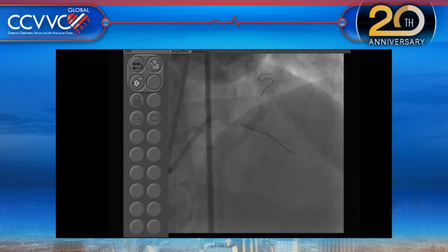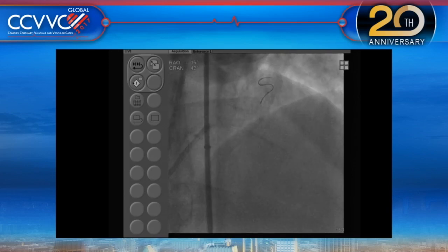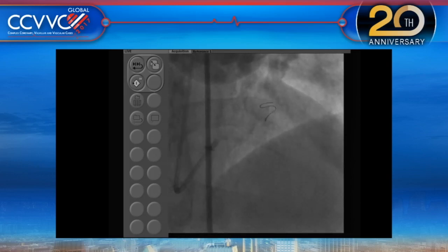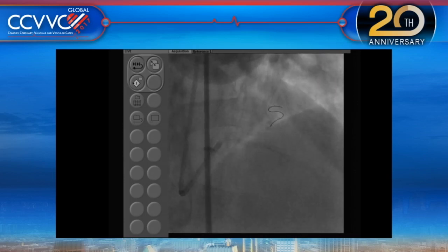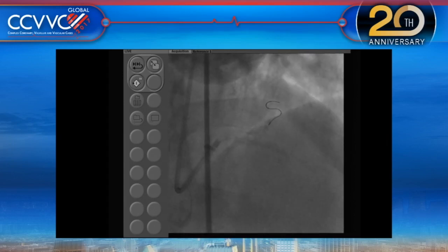You're right, that is always the question, the concern in these complex cases, that even if you've done the rota, it's a bifurcation and the other vessel is also calcific. But if you have done a good balloon dilatation and there is no significant dissection, you could just take the wire out, put a wire into the main vessel and then do the atherectomy. In this particular case, because of complexity, the tightest lesion was the left main to circumflex, which has been taken care of.